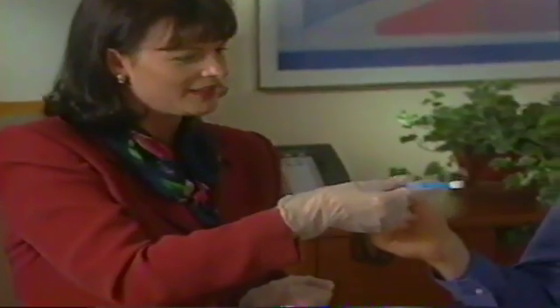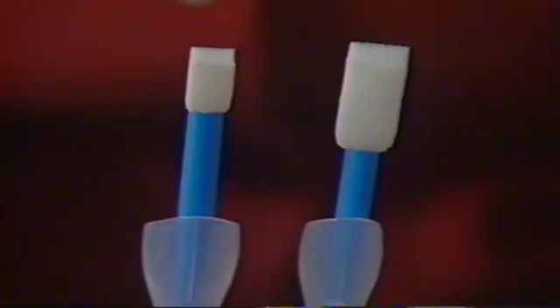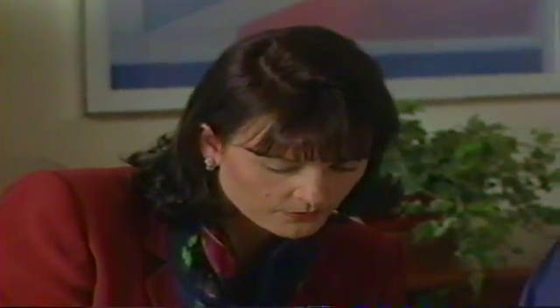Next, remove the collector and hold it horizontally to the table. Note, the foam will swell to about 150% of the original size as oral fluid is collected, indicating a proper amount of fluid is available. If the collector does not appear to have enough oral fluid, it can be reintroduced into the mouth or a new collector can be used. Additional collectors are available from your oral screen supplier.